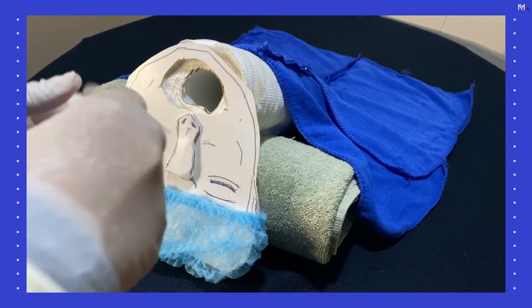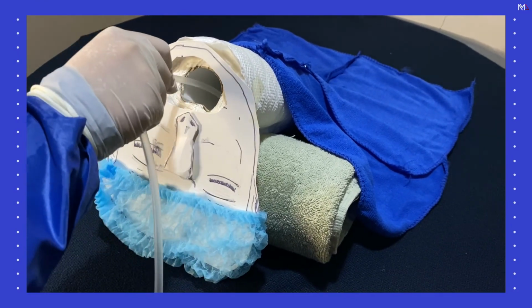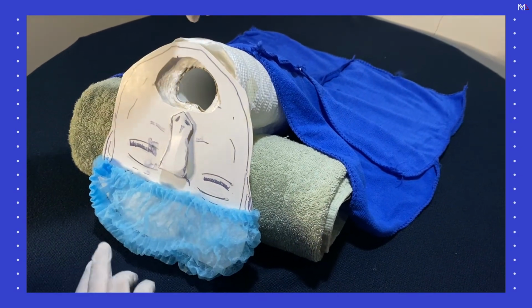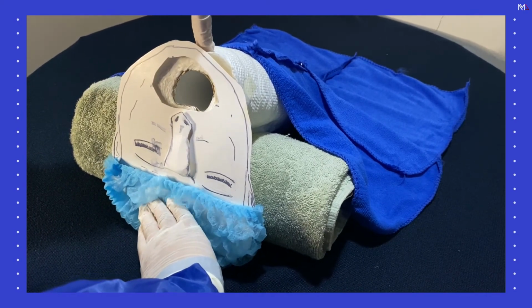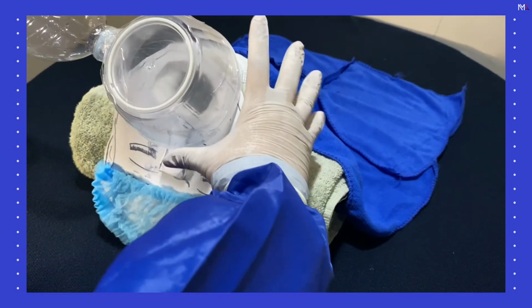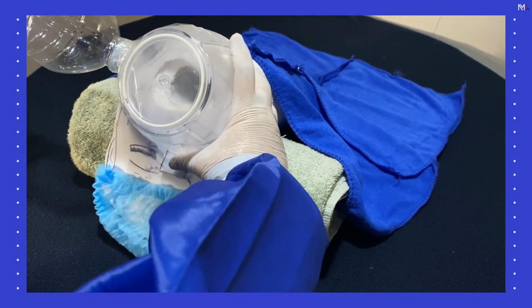First, suction any pooled secretions. The head tilt chin lift is then used to open the airway of an unconscious patient as it causes anterior displacement of the tongue. A bag valve mask is then used to pre-oxygenate the patient to replace the nitrogen volume in the lungs with oxygen to provide an apneic oxygen reservoir.